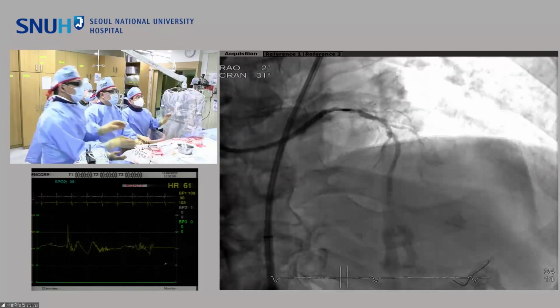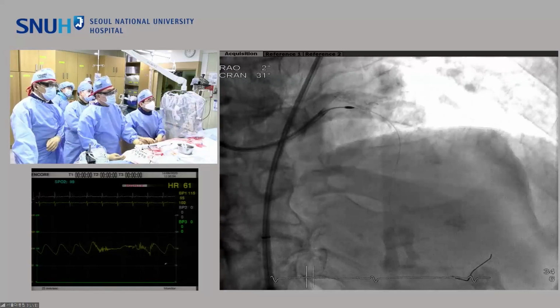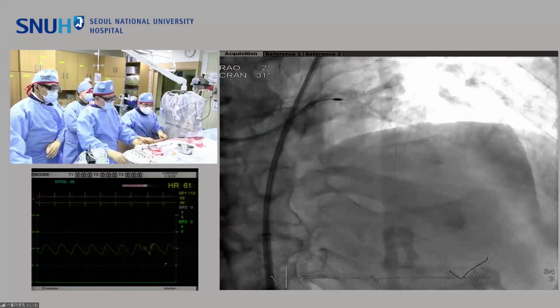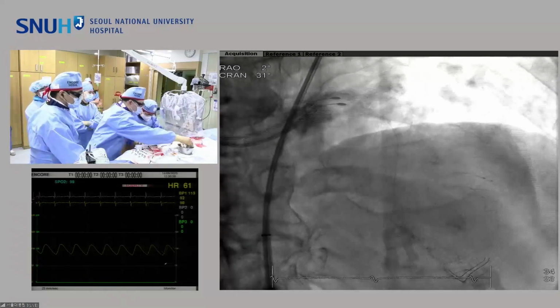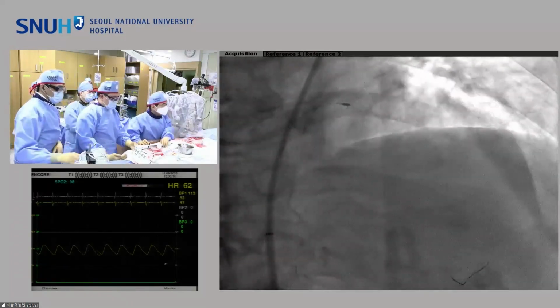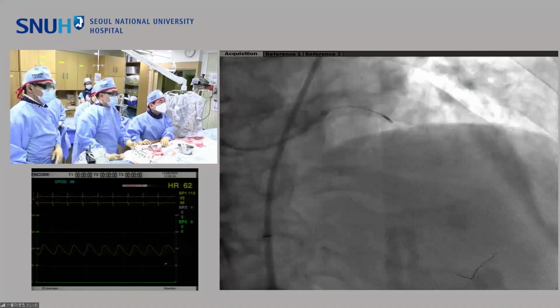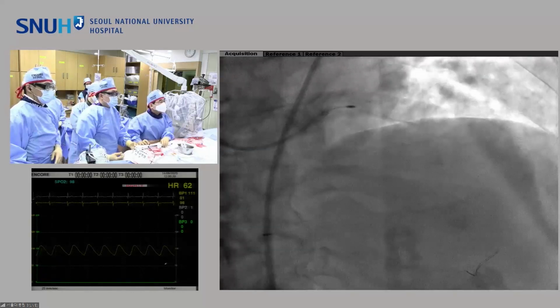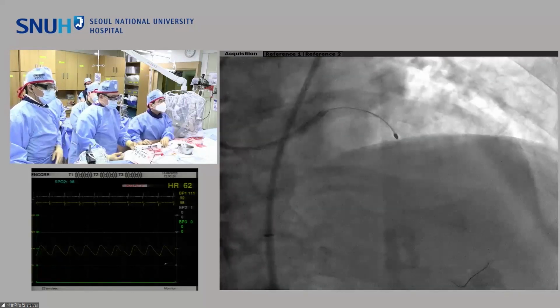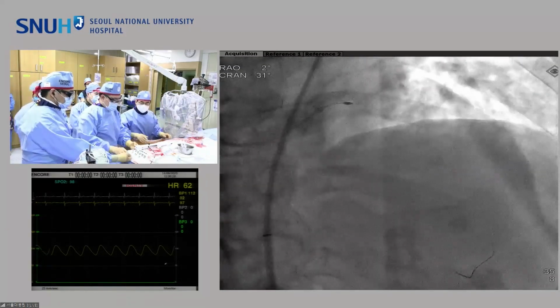Well ablated. Just one single bar, 1.5. Okay, once again, I try to ablate this lesion with low speed. 140. Okay, just ROTA, dynaglide retreat.